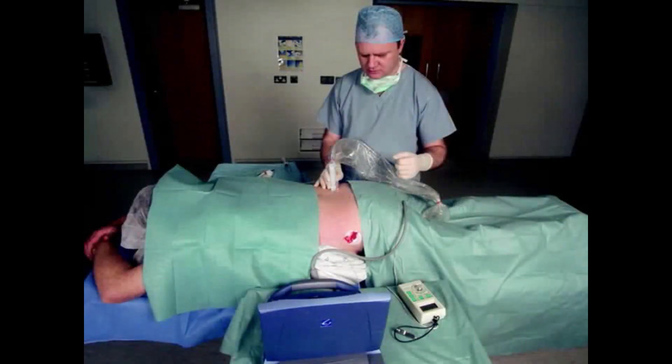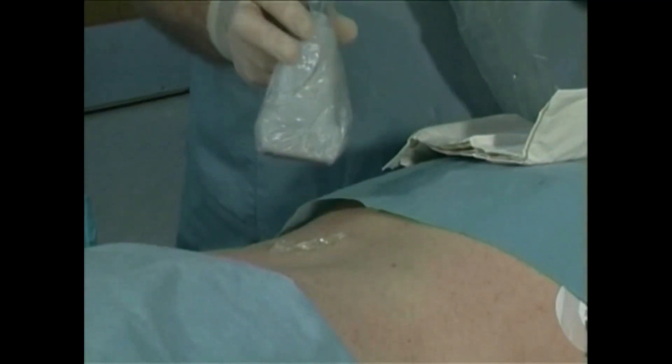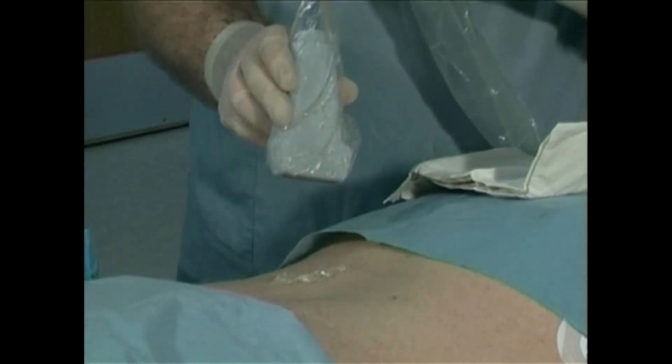The patient should be placed in prone position with a pillow under the lower abdomen to minimize lumbar lordosis. The practitioner should stand on the same side of the patient to be blocked, while the ultrasound screen is placed opposite the physician. Sedation is required to keep the patient comfortable during the procedure. The patient needs to be prepped and draped in sterile fashion prior to beginning. Cover the ultrasound probe with gel and place it inside a sterile sheath, and spread sterile gel onto the patient's lower back on the side to be blocked.